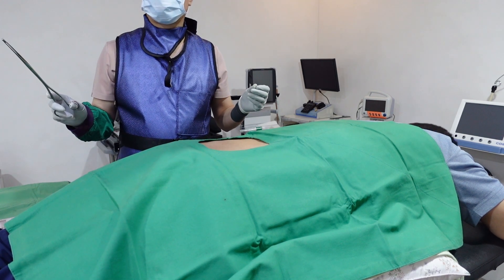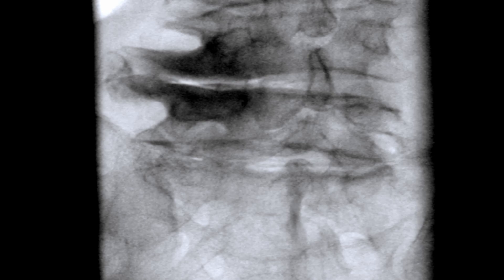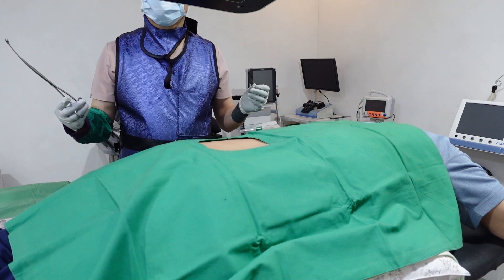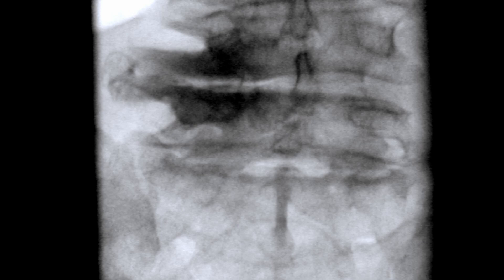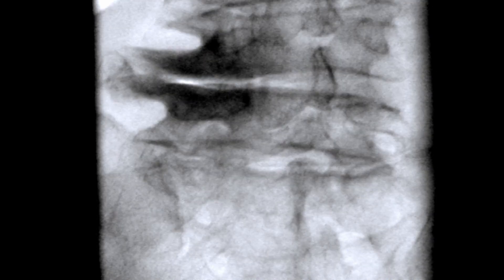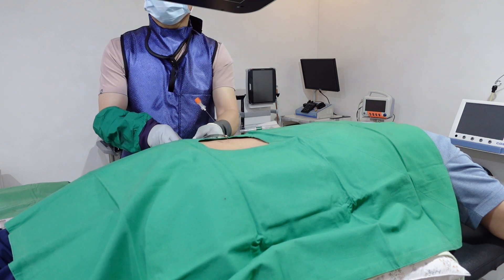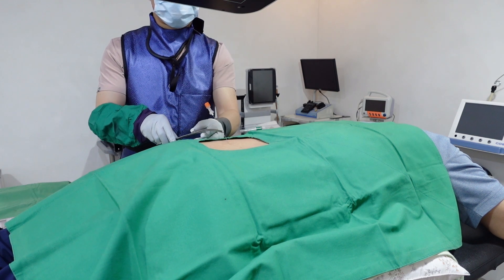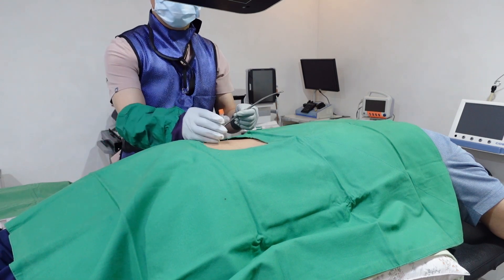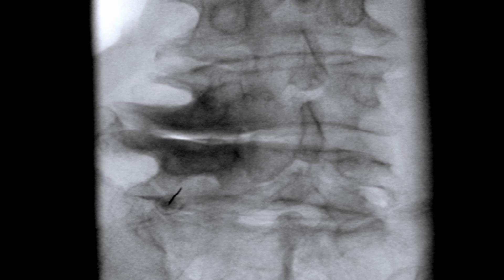The procedure starts with adjustments to the C-arm to capture a view of the vertebral endplate. This adjustment is accomplished by delicately tilting the C-arm and securing a left ipsilateral oblique view. In this case, the opening window for the transforaminal injection isn't ideal due to mild vertebral body collapse, an inferior downward proliferation of the transverse process, and hypertrophy of the superior articular process of S1. As a result, precise adjustments to the C-arm angle are imperative to maximize the opening of the intervertebral foraminal space. After determining the needle trajectory, the procedure begins. Typically, the skin is punctured at a location inferior to the anticipated target area to avoid contact with the bone of the transverse process.